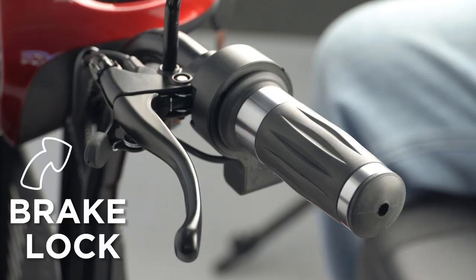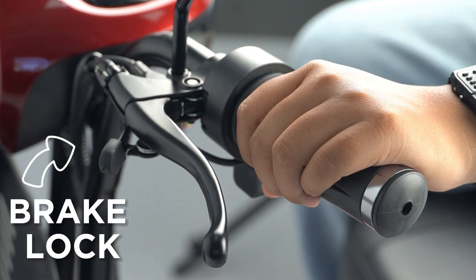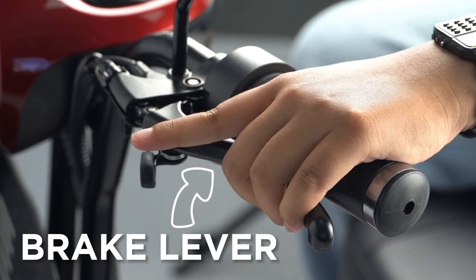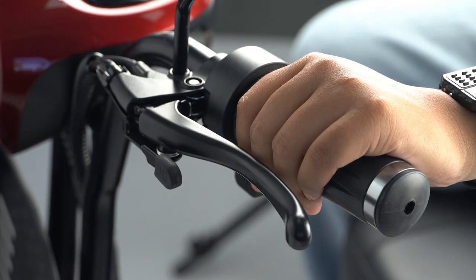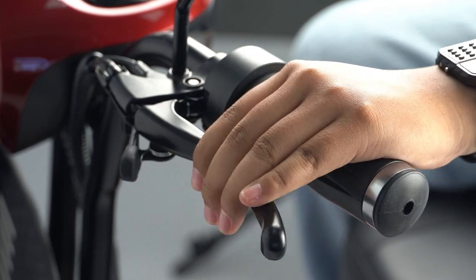Brakes: There is an inbuilt brake lock. To engage the brake lock, pull and hold the brake lever while you pull the brake lock. To disengage the brake lock, pull and release the brake handle.